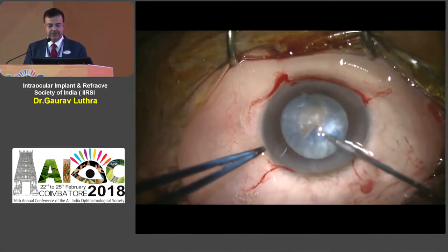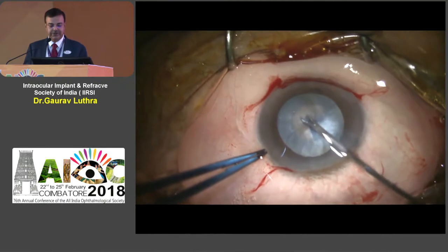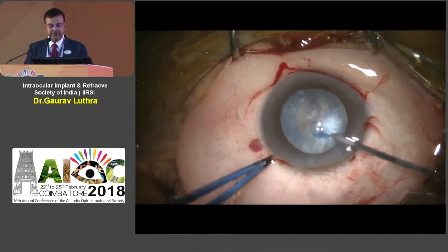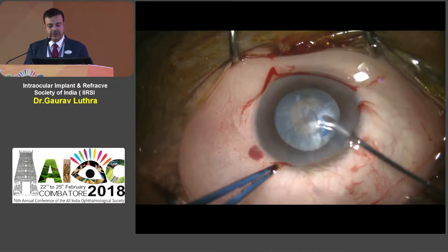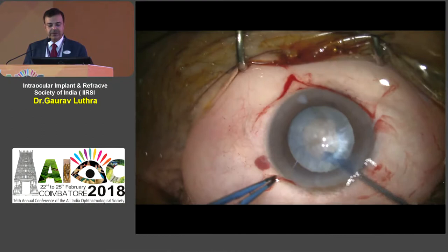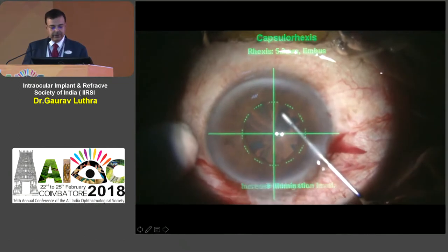At this point it is most productive to put in sodium hyaluronate and make sure the capsule is pushed back as much as possible. You always get much better control with the rhexis forceps. Nowadays you have excellent micro-rhexis forceps available which are much easier to maneuver inside the eye — they don't cause shallowing of the chamber, don't allow viscoelastic to come out, and can be used from the side port or the main port as convenient.